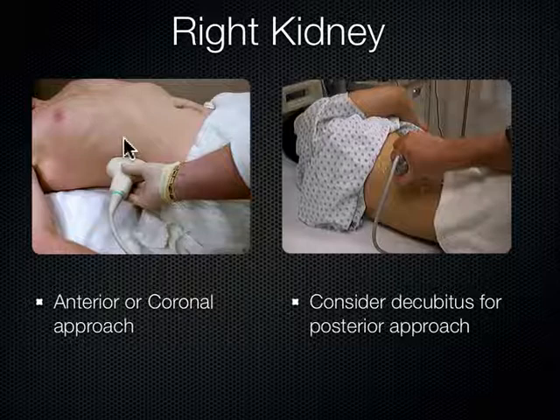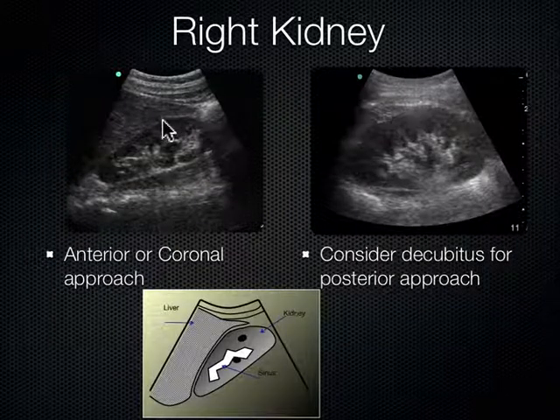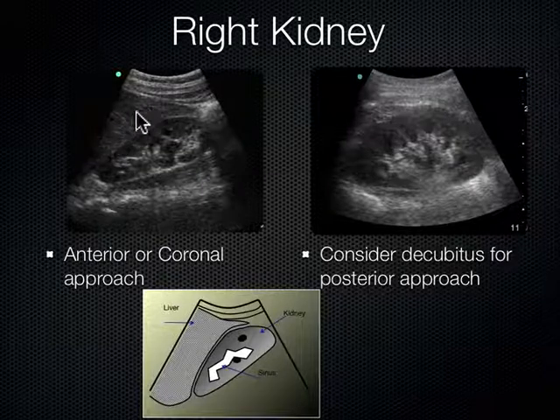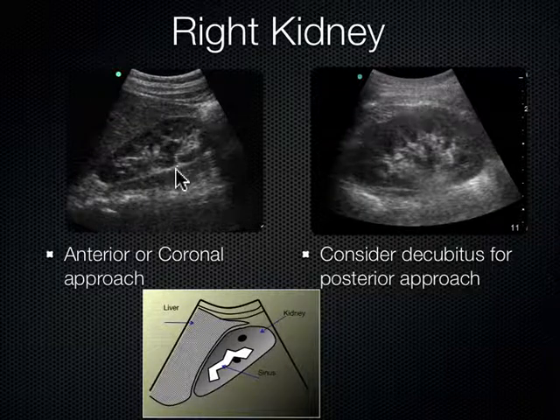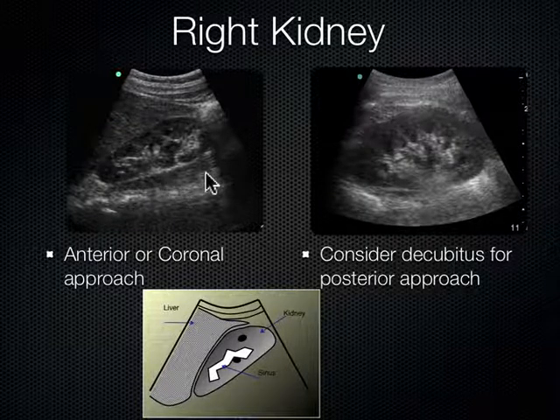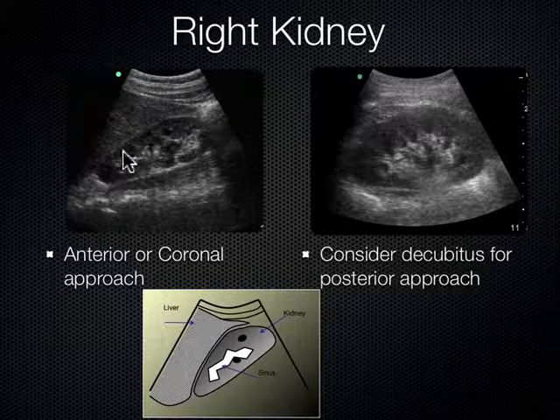If you can't get a good view that way, you can roll the patient into left lateral decubitus — decubitus means on their side — and look between the ribs from a posterior approach. You can see the kidney along the liver as your window, and as we go more posterior, there's another structure behind the kidney called the psoas muscle, which lies right on top of the spine. So the layers are: spine, psoas, kidney, liver. This shows the upper, mid, and lower poles of the kidney.